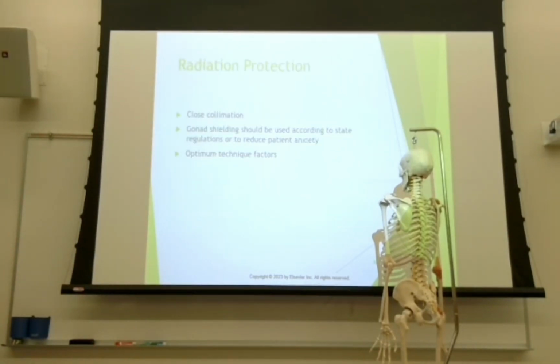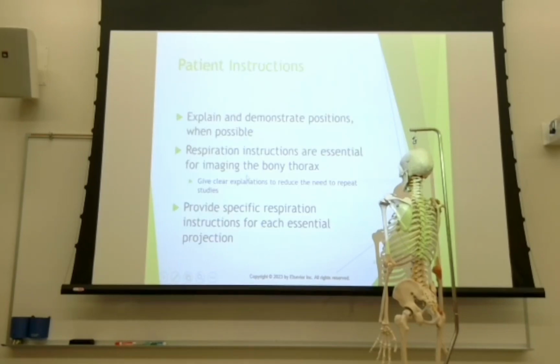Markers, use them. Radiation protection, collimation is your most common. Remember your shielding, that is kind of up in the air at this point. Whether or not you use shielding would be according to your clinical site's recommendations or requirements. And then certainly you want to optimize your technical factors.